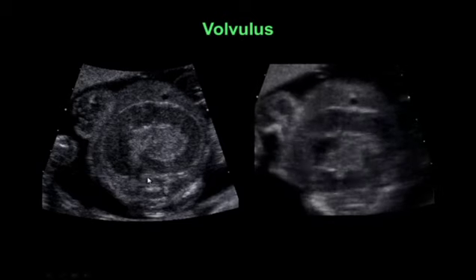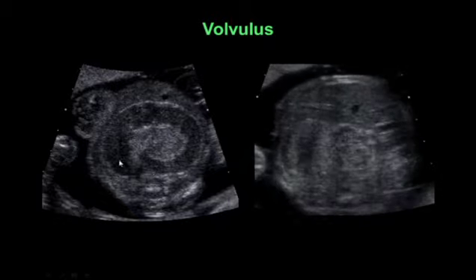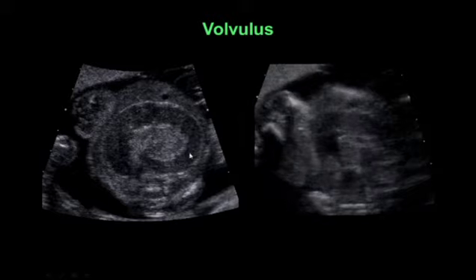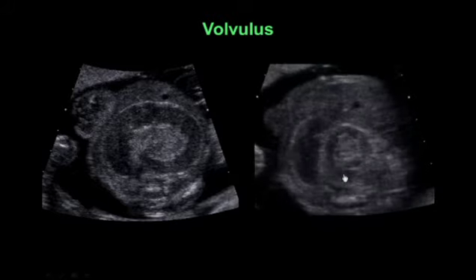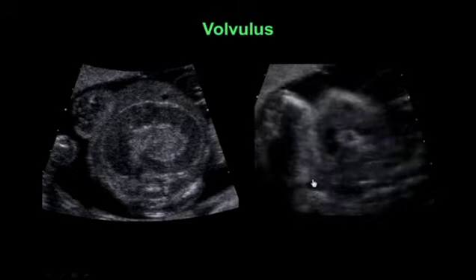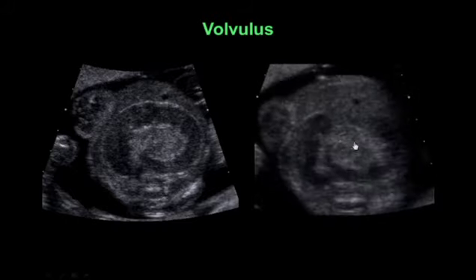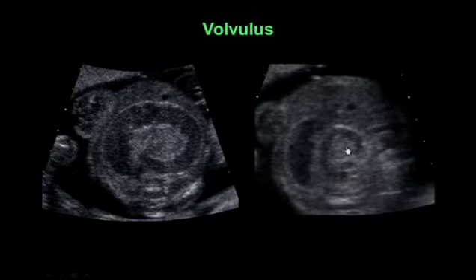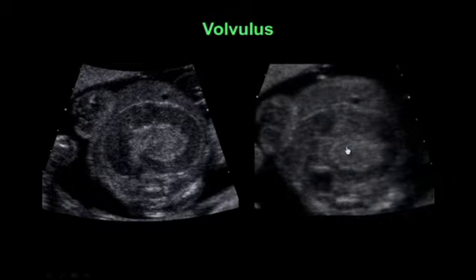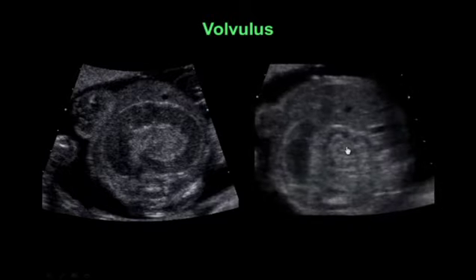So here's a case of a volvulus where we have that whirlpool sign. You can see on the still image a dilated loop of bowel that spins around on itself, and when we look at the clip we can see it curls around and around and around. Here is the big dilated loop, and then as we come down we see it curling around itself. This is called the whirlpool sign. These are loops of bowel twisted on themselves that will obstruct the flow of fluid and contents in the gastrointestinal tract.